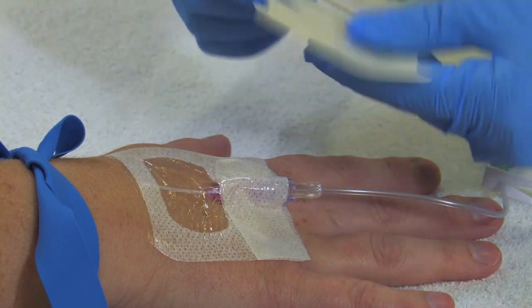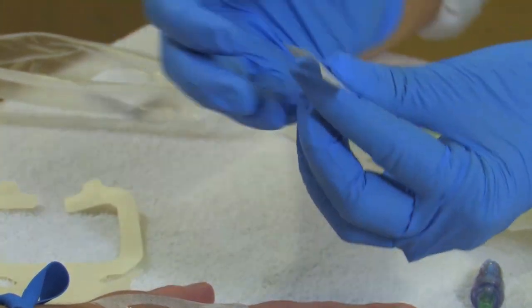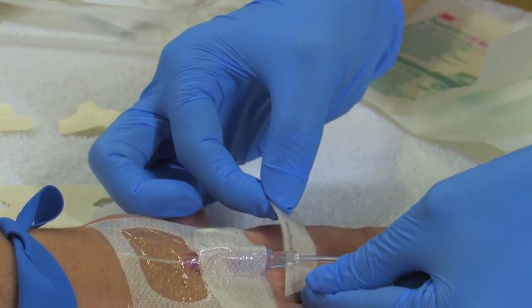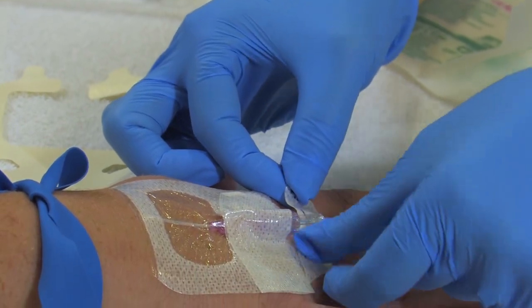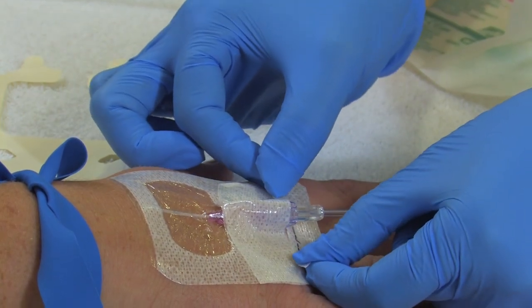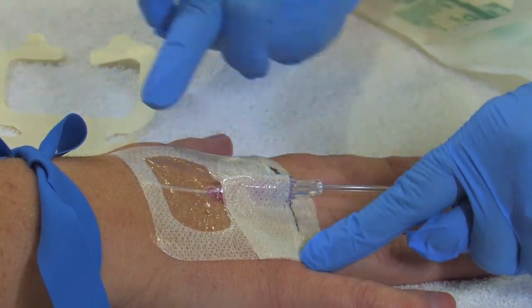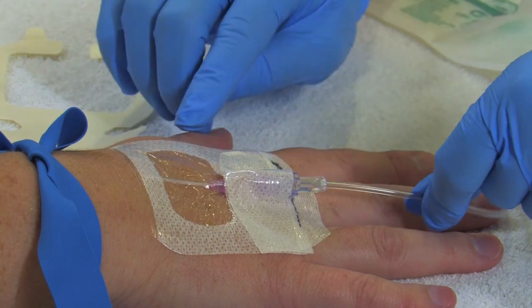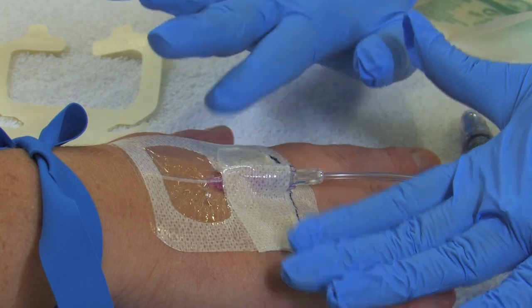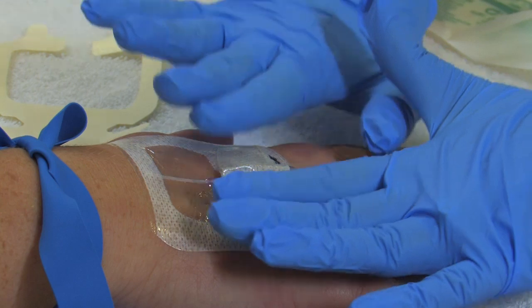And then last but not least, we want to date, time, and initial. And then we want to take the long edge here, and slide it underneath the luer lock, and adhere it so that the long edge is just lining up and just covering the edge of the main window. Okay, so that we get pull and tug force here. And then once everything is properly taped down, again, we want to make sure that we smooth it all down so it's nice and taut.